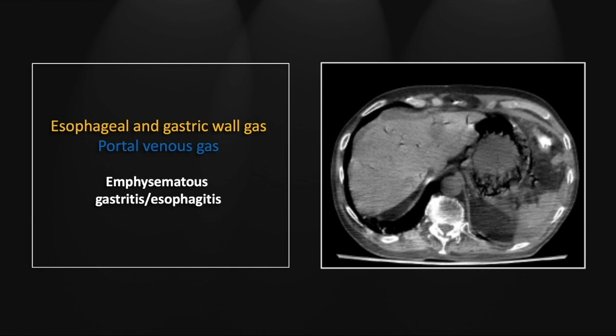In the abdomen, there is extensive gastric pneumatosis, and in addition, peripheral, arborizing, linear gas collections in the liver consistent with portal venous gas.